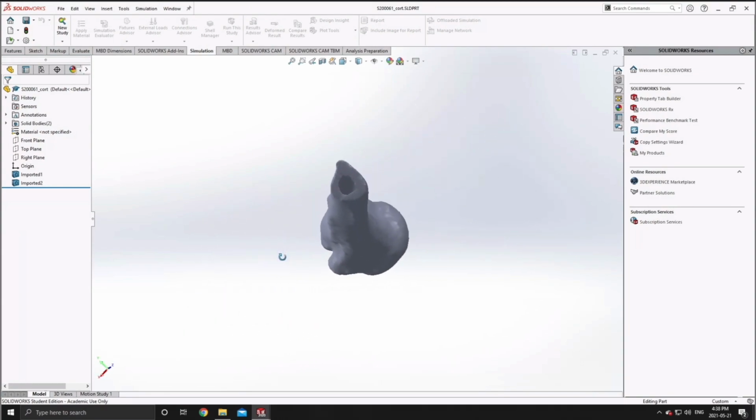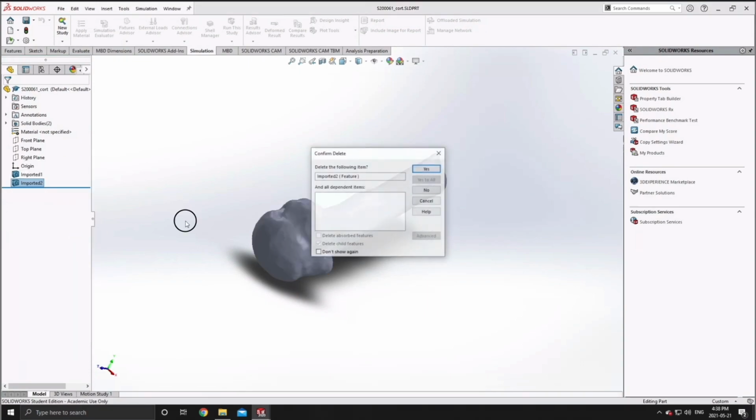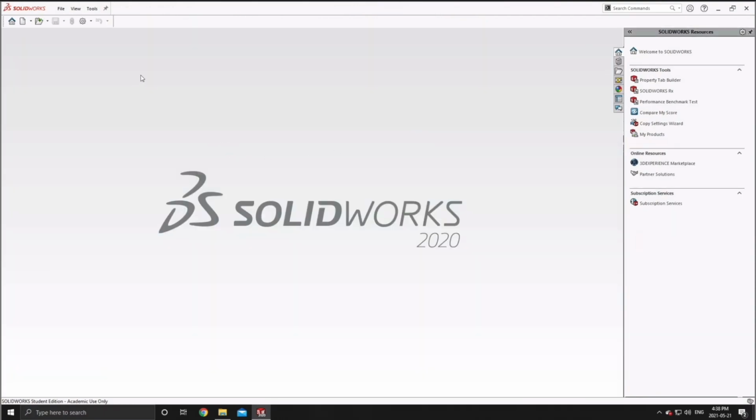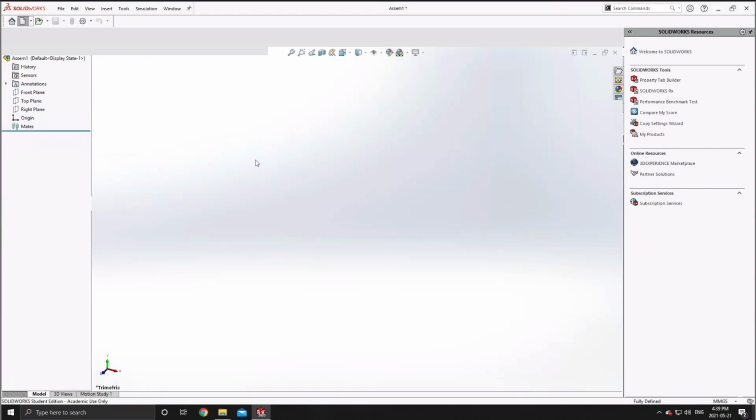So after your bone models have been successfully imported, just make sure you delete any disassociated solid bodies, as it will slow down processing later on. And now we're ready to start creating the assembly.